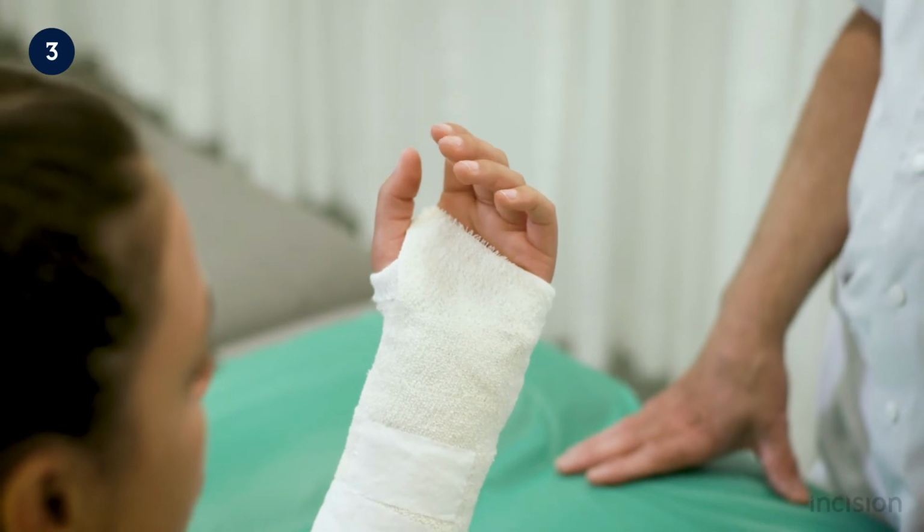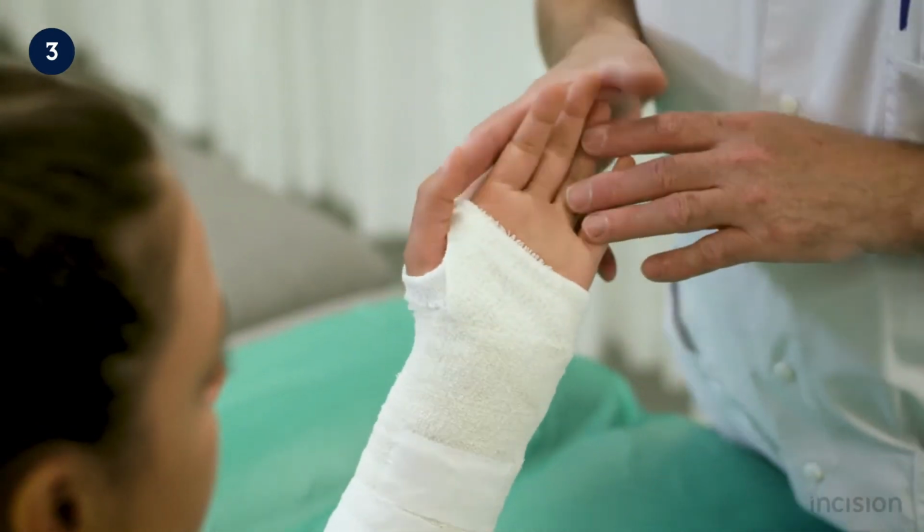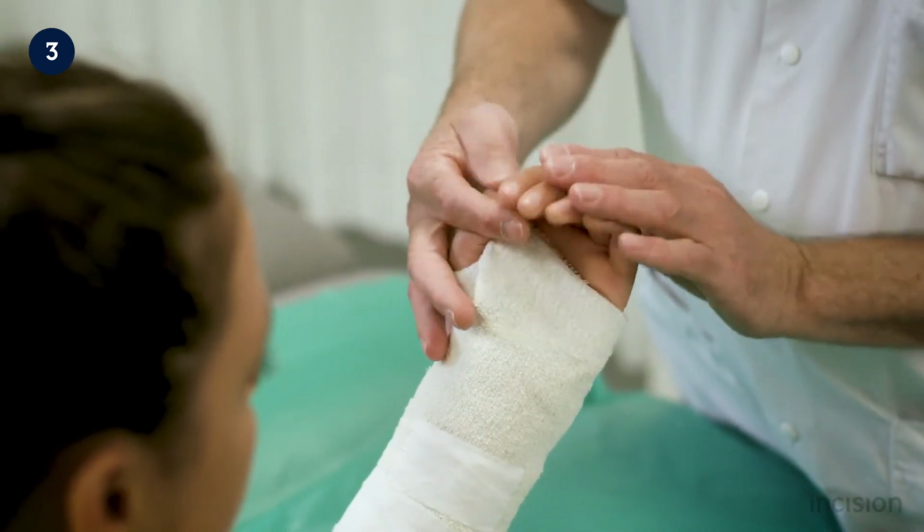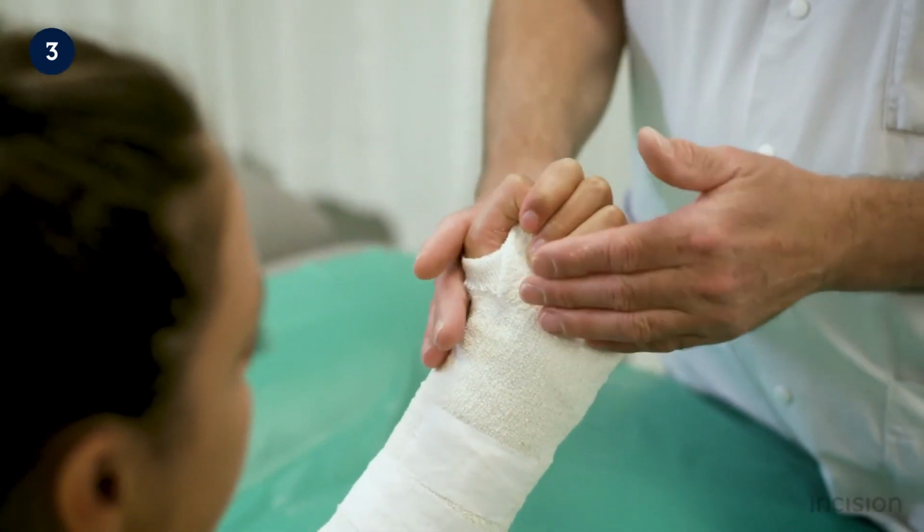Following the application of the splint, it is important to check if the palmar crease is exposed and the patient is able to flex the metacarpophalangeal joints. Note that the thumb is able to fully abduct.